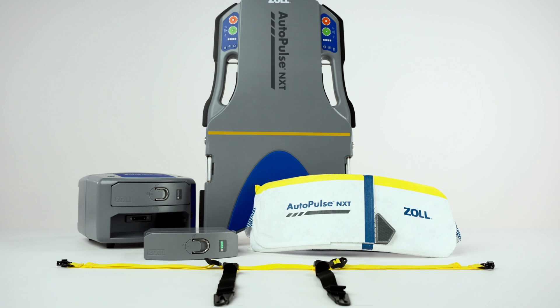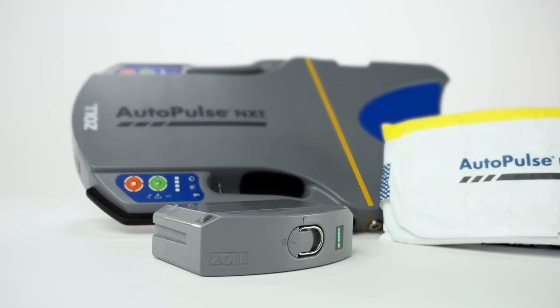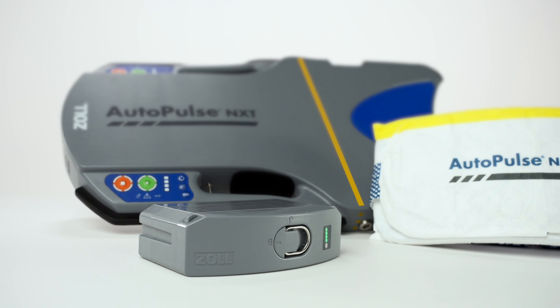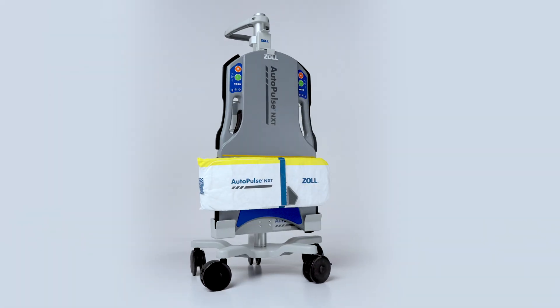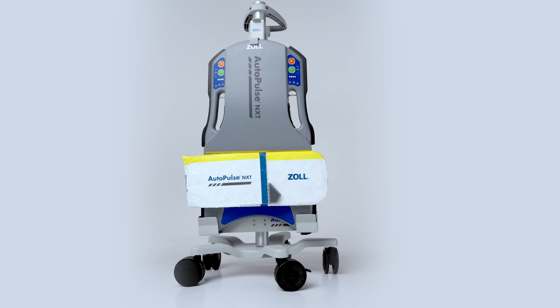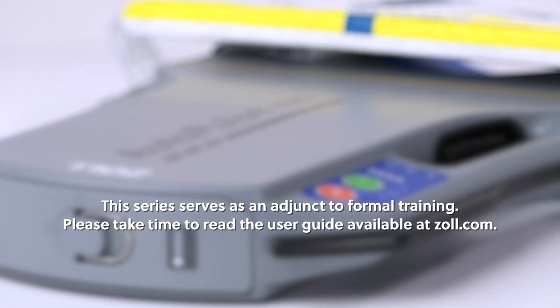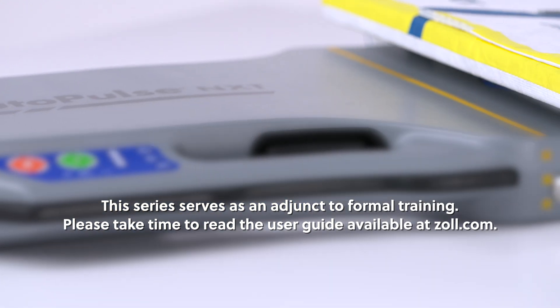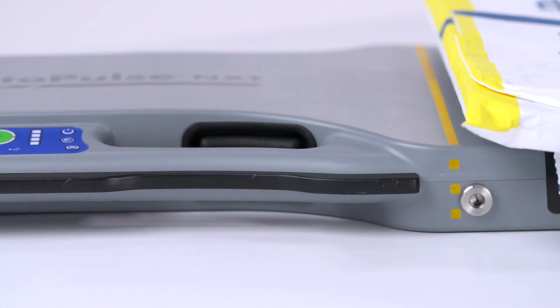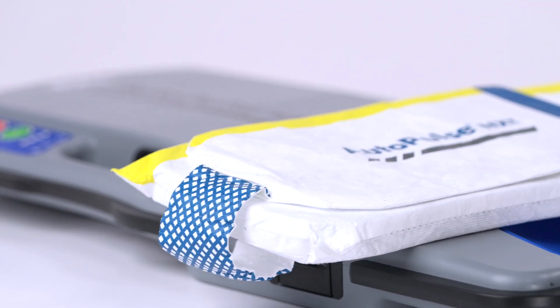Welcome to the AutoPulse NXT Resuscitation System In-Service Video Series. This multi-part series provides detailed information about the AutoPulse NXT Mechanical CPR device and its functionality. This series serves as an adjunct to formal training. Please take time to read the Operator's Manual, available at zoll.com. Proper use of the system requires a thorough understanding of the product, appropriate training, and practice.